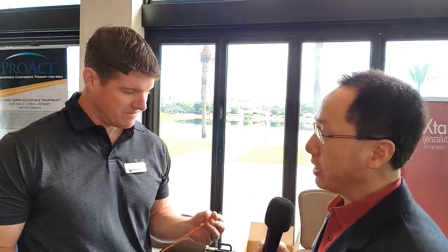Let's talk about first things first. I have been using ureteral access sheaths for a while, and I've been using the Cook access sheath because it requires only a single wire to gain access and also deploy the access sheath. Now, I've recently started using the ReTrace by Coloplast. Tell us a little bit more about this and why I started using this instead of the Cook product.